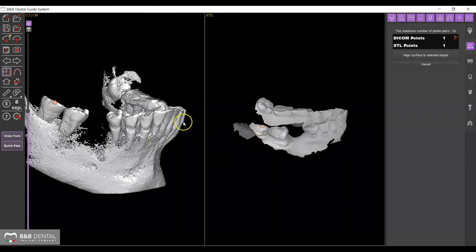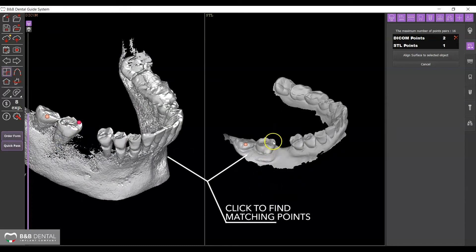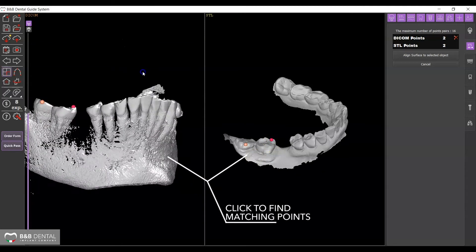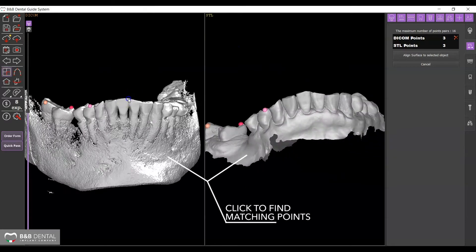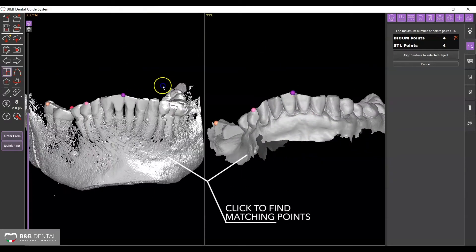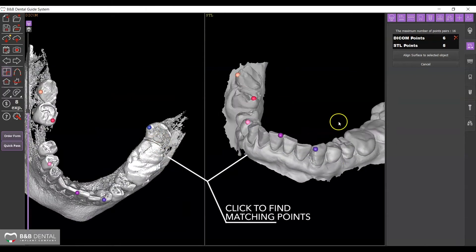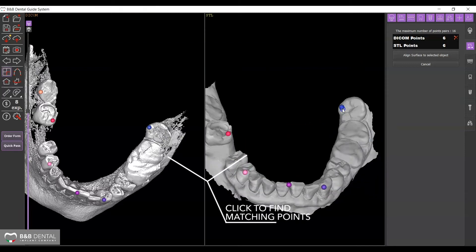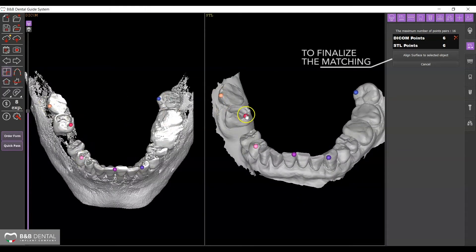Proceed by selecting at least five points on the arch, making sure that they are all equally distributed. The selection must be made on one file first and then on the other by applying the points in the same position.